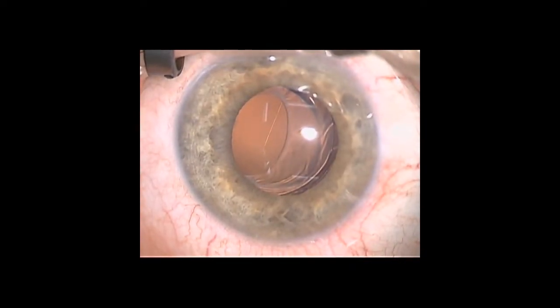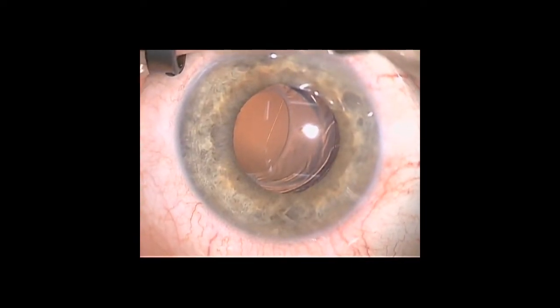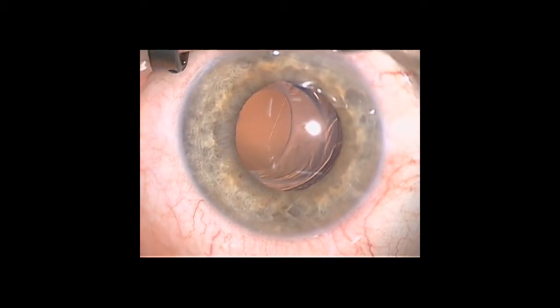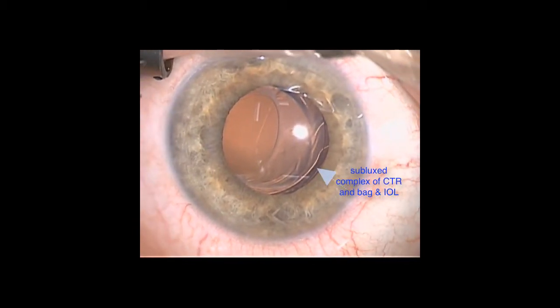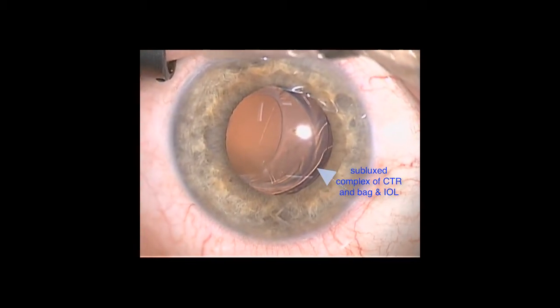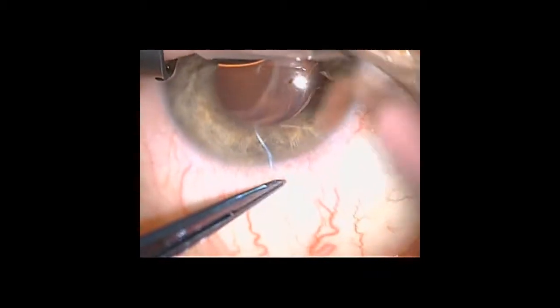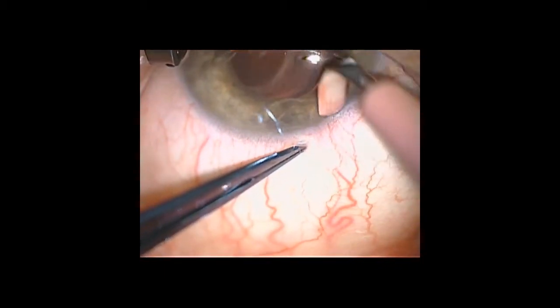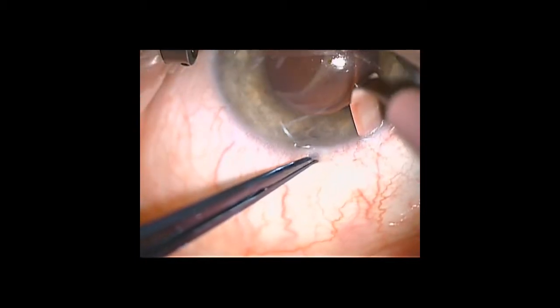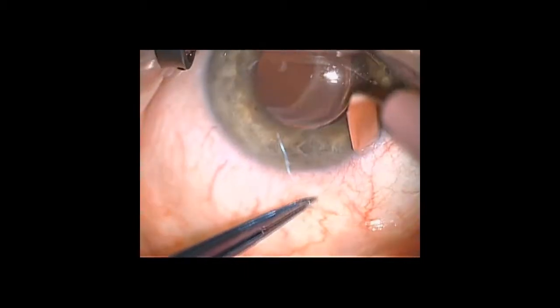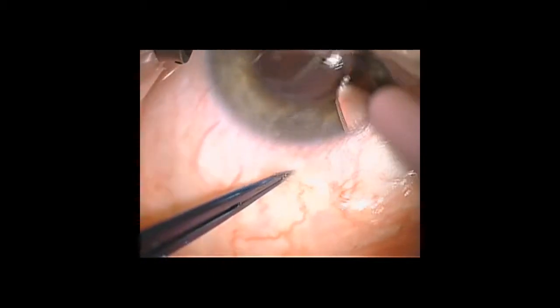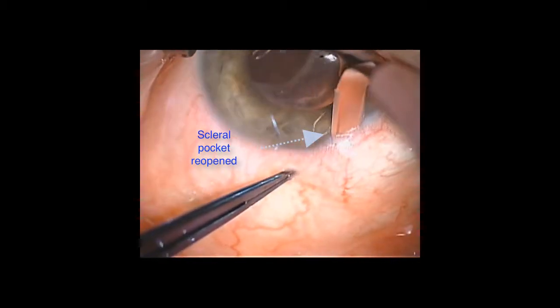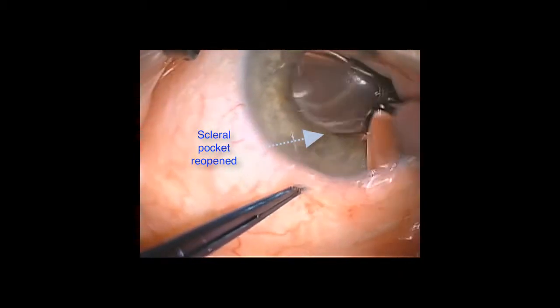Unfortunately, as might have been predicted, early fibrosis of the capsule has resulted in subluxation away from the area of weakness towards the strong zonules. There is no vitreous prolapse obvious. Infranasal zonule weakness has occurred secondary to trauma, so there is no chronic degenerative disease causing progressive, more widespread zonular weakness.